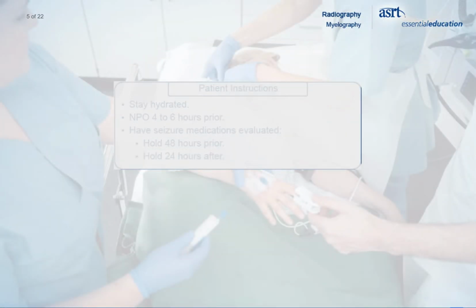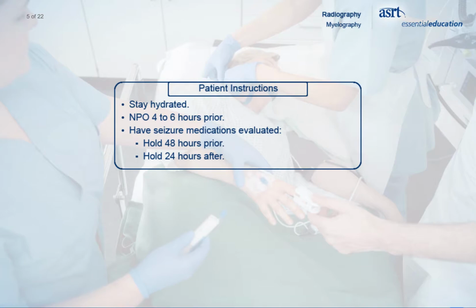Before the procedure, patients should be evaluated and have the procedure cleared by a physician. Ensure the patient is well hydrated before the procedure. The patient should have nothing by mouth for 4 to 6 hours before the procedure, and any medications which decrease seizure threshold should be evaluated by a physician. These medications may need to be withheld 48 hours before the procedure and for 24 hours after the procedure.